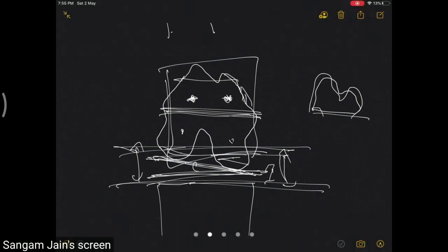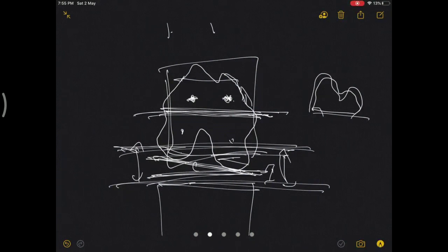A few things which can be used even in the worst case scenarios: the transepicondylar axis is the constant thing which you can use. So whatever pins you put have to be parallel to this, and to the proximal tibial cut, which has to be parallel to the anticipated cut which you're going to use.